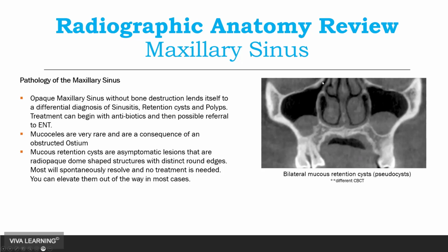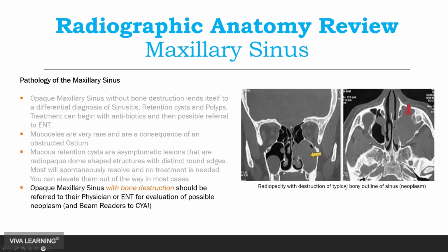This is the ostium as it leaves the sinus. See how high that is? You want to make sure that if you have a large retention cyst, you're not going to push it and block that. Okay. Things like this that are a completely opaque sinus with some destruction should be referred to an ENT immediately, and probably have it also sent to an oral and maxillofacial radiologist.